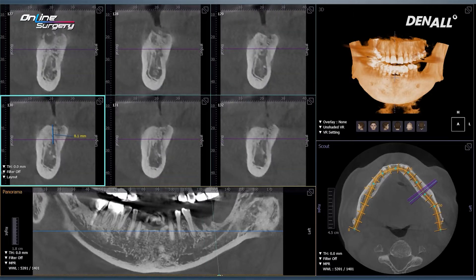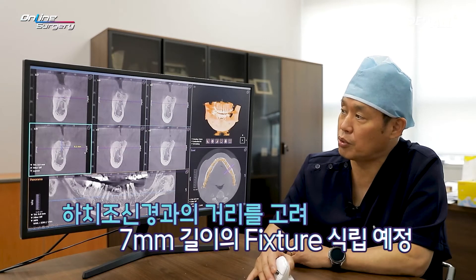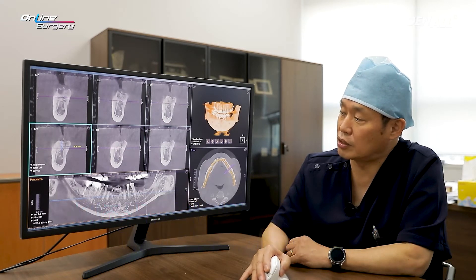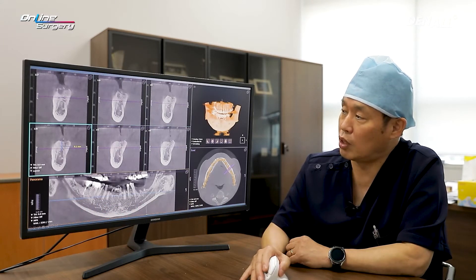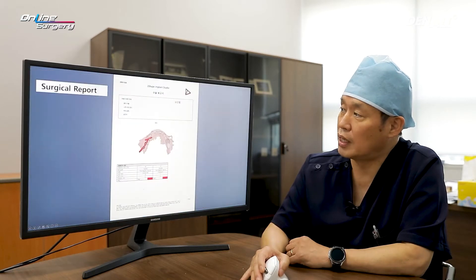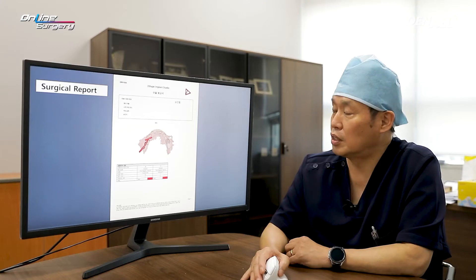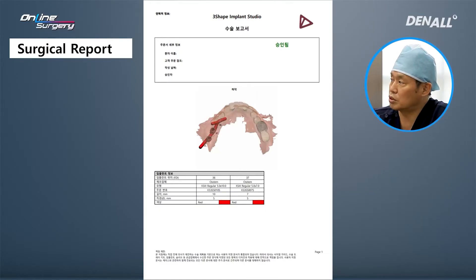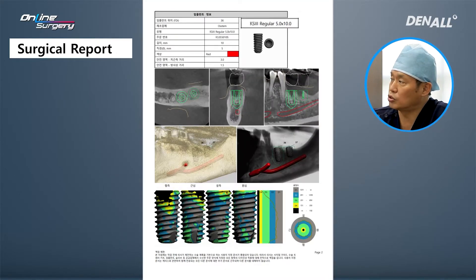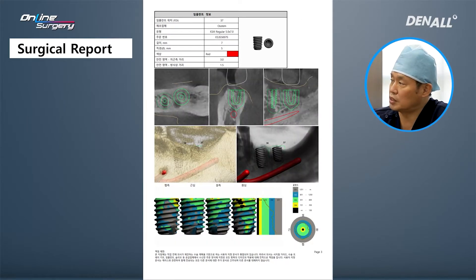The distance to the inferior alveolar nerve is approximately 8 to 9 mm. In order to have secure space, I plan to place a 7 mm implant. Distal to tooth number 36, the alveolar bone is slightly higher and using this as a basis, implant placement was planned. I talked with the one guide team to come up with a surgical plan. In number 36, a diameter 5.0 KS3 implant of 10 mm was planned, and the distance with the inferior alveolar nerve was okay. In number 37, the distance with the inferior alveolar nerve is approximately 9 to 10 mm, but I want it to be safe and place it conservatively, so I plan for a 5.0 by 7 mm implant.